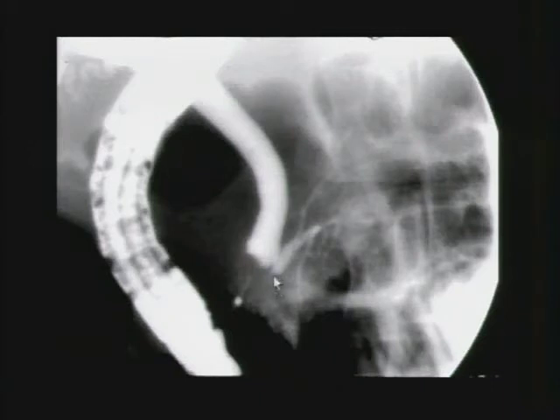You inject the duct of Wirsung through the major papilla, and you see a shortened main duct. However, when you look at the termination, and this is the key, look at the end, you'll see that there are branches that actually come off of this shortened duct. Here again is a patient with pancreas divisum, a truncated duct, but you see normal branching at its tip.